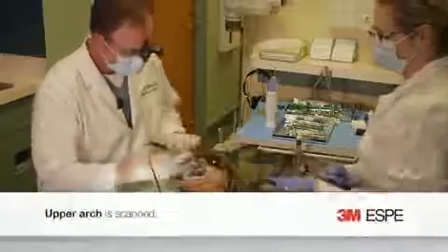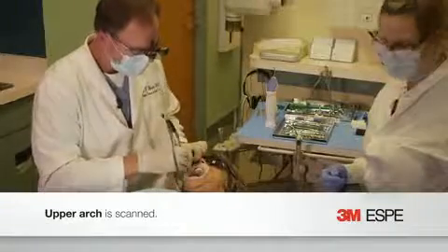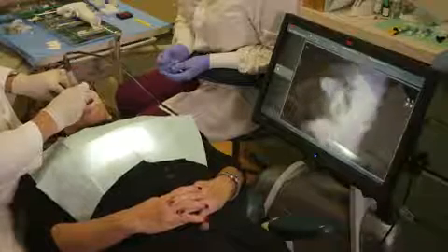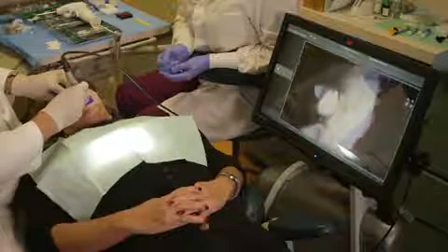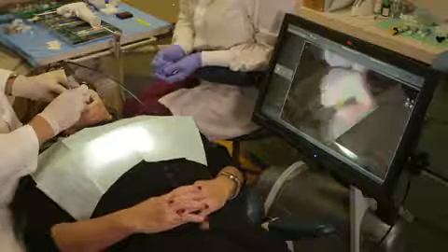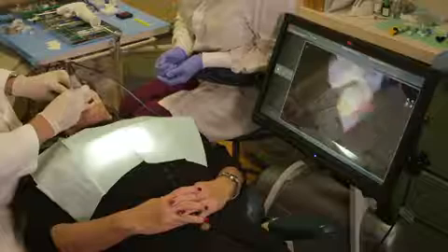We're going to go ahead and start our upper scan, and as soon as we complete our upper scan, we'll go to the lower. With this new design and the smaller handpiece, I can actually scan sitting down, which is kind of nice. Usually we can get an entire scan in a couple of minutes.